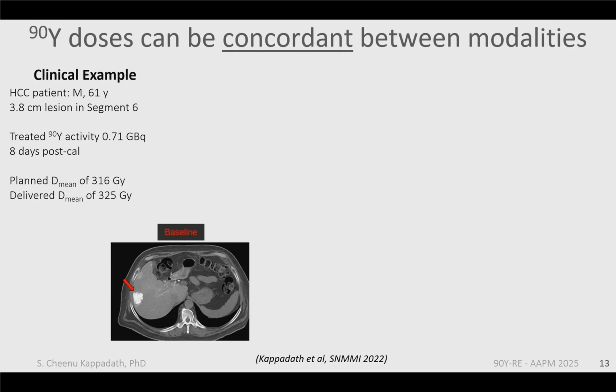So there's lots of imaging, and I want to just demonstrate that if we do the hard work, you can actually make these doses concordant, right? It's something that we have learned over the past 10 years, to really pay attention to detail, and I'm just going to illustrate how this can be accomplished.